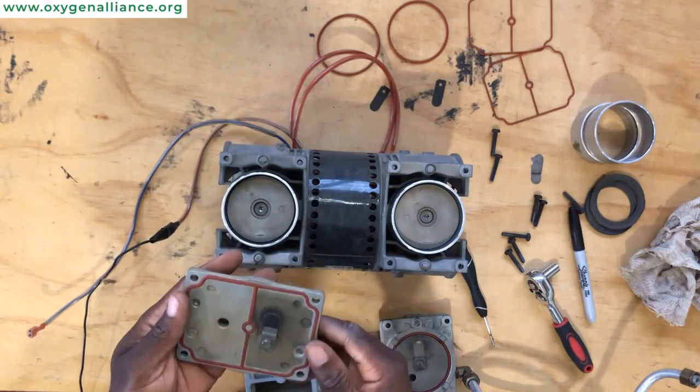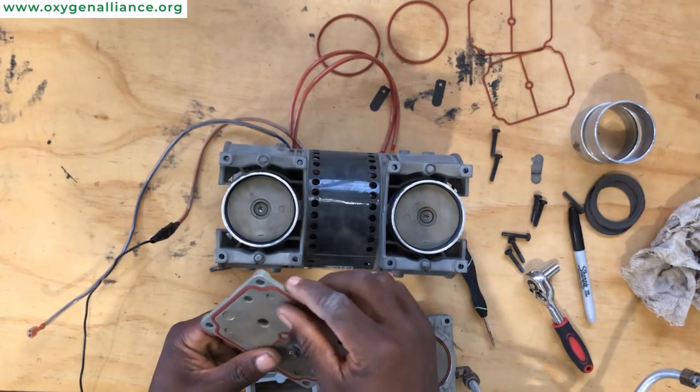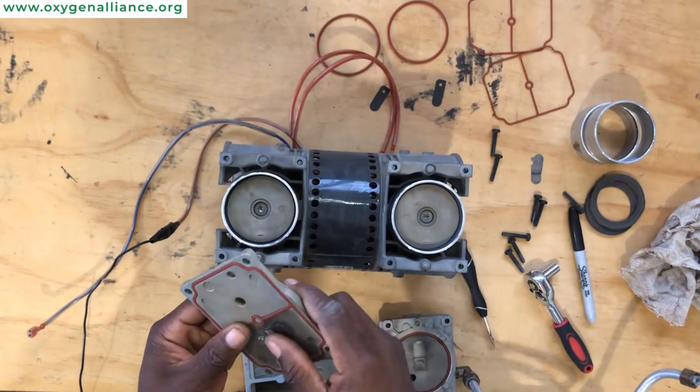Once you're satisfied with the other side, you can now move on to changing the flapper valve on the next one.